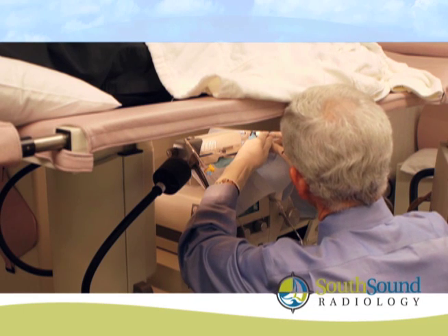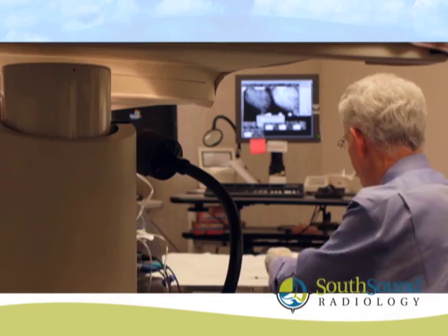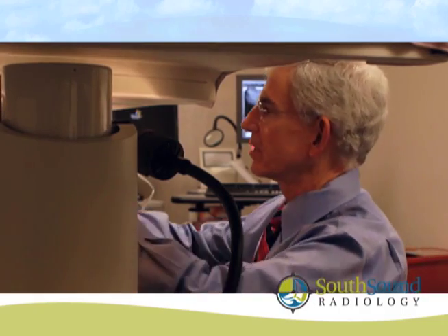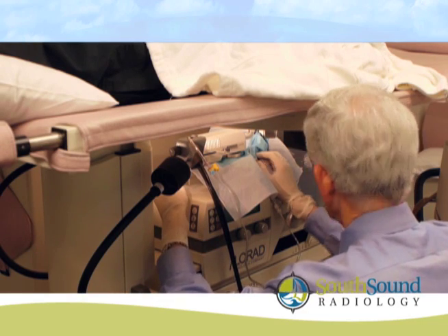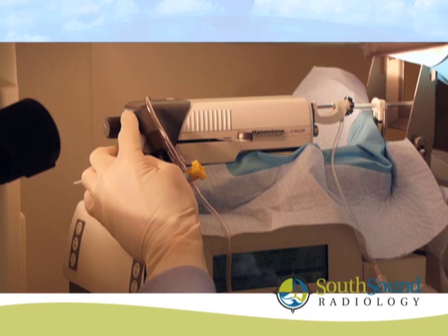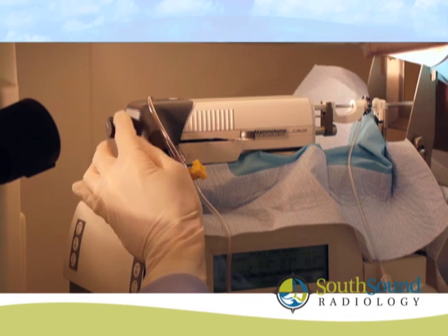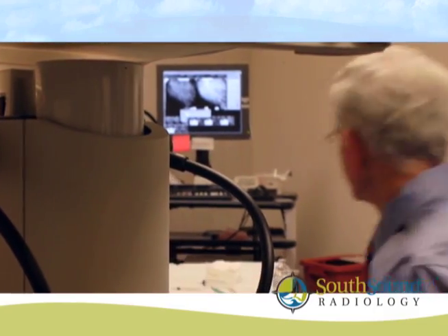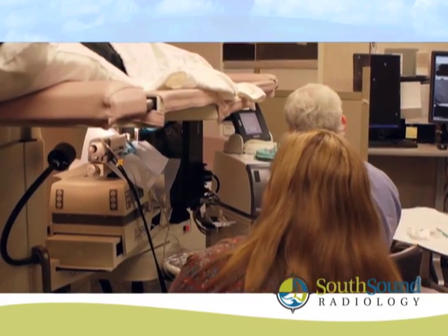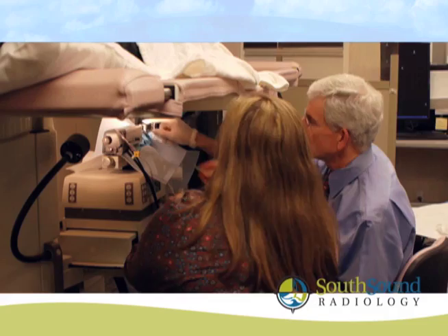You may feel a stinging sensation at first, but then you should not experience any pain. A tiny nick is made in the skin, and the biopsy needle is inserted partway into the breast. Additional images are taken to check positioning of the biopsy needle. You will hear a click sound as the needle is advanced into position, and another image is taken to confirm optimal positioning. The technologist will then turn on a vacuum-assisted device that enables the tissue samples to be obtained.